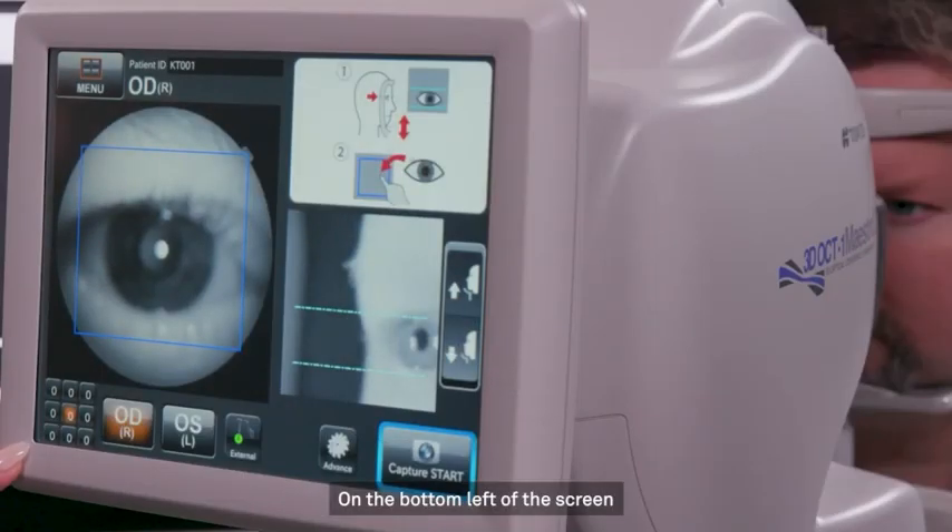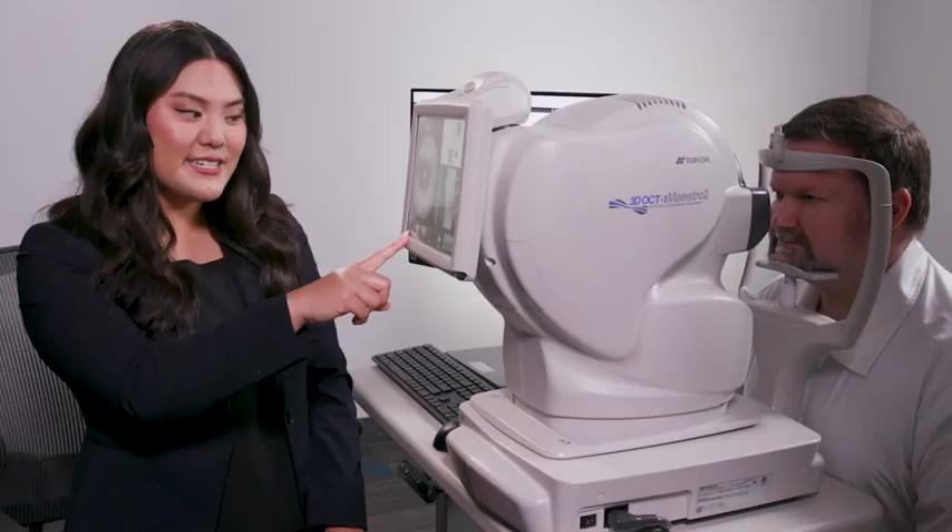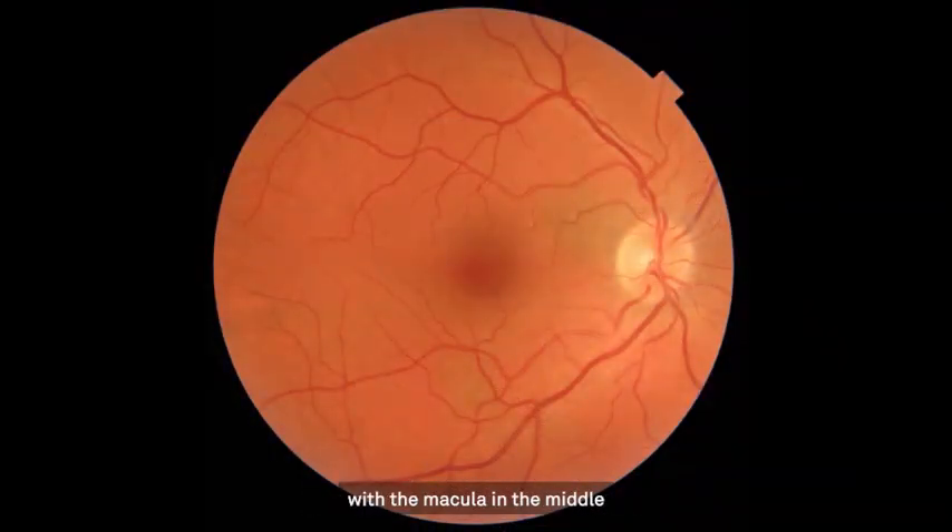On the bottom left of the screen is a grid of zeros. Each of these boxes is a fixation point for the patient to look at. It's advised that you start with the center button first, as that's going to give us a standard 45 degree view of the retina, with the macula in the middle and the optic disc on one side.